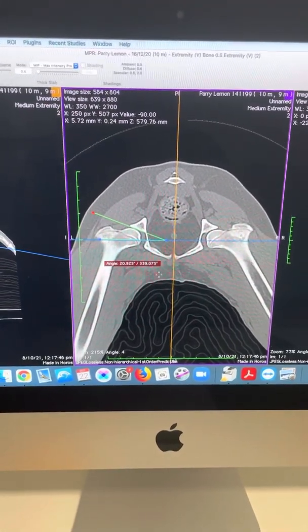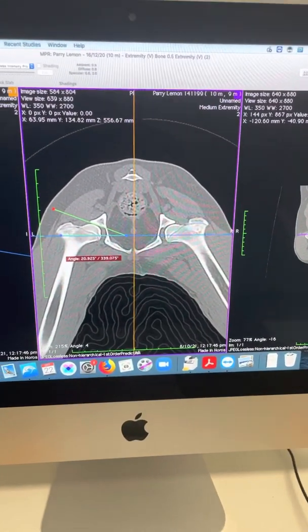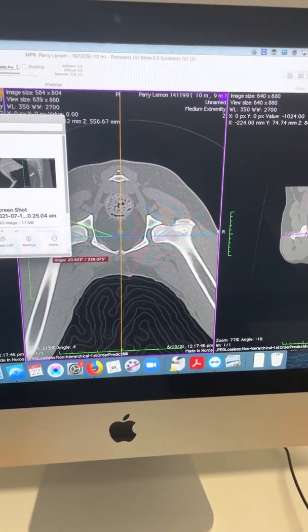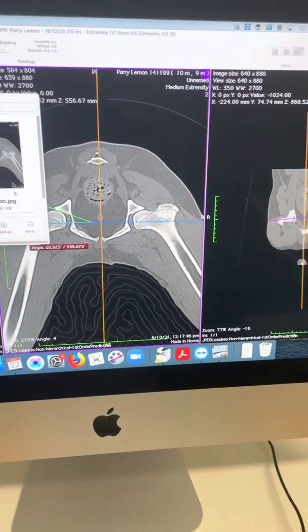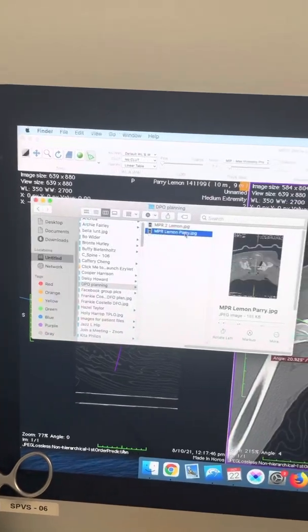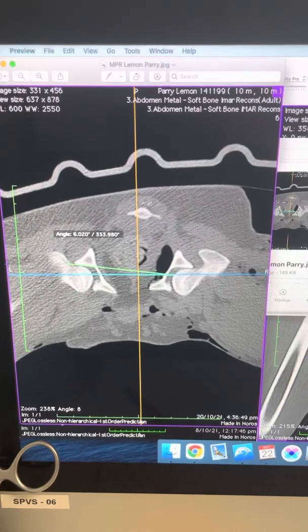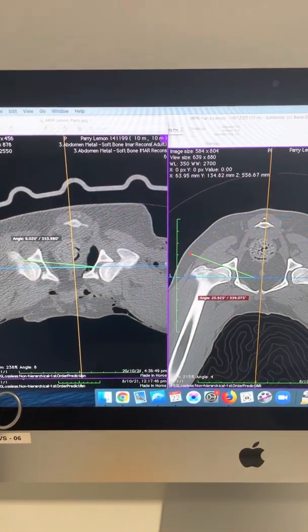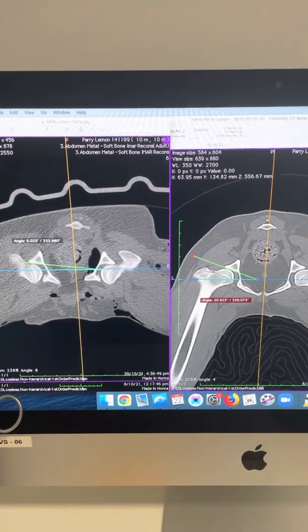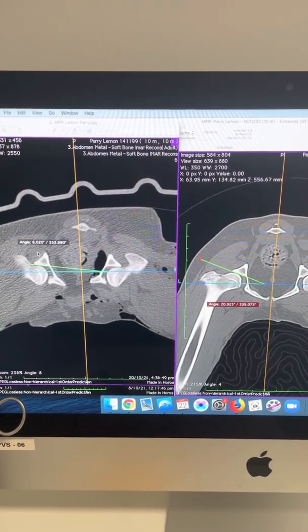In this dog we measured 20 to 21 degrees, we put on a 25-degree plate, and what we actually got in the post-op period was an angle that was lower — about six degrees. So we can look at these side by side. We can see that our angle has changed; the reference marks are basically the same, the pelvis is a little bit skewed from this view, but we can see our angle has changed to six degrees.